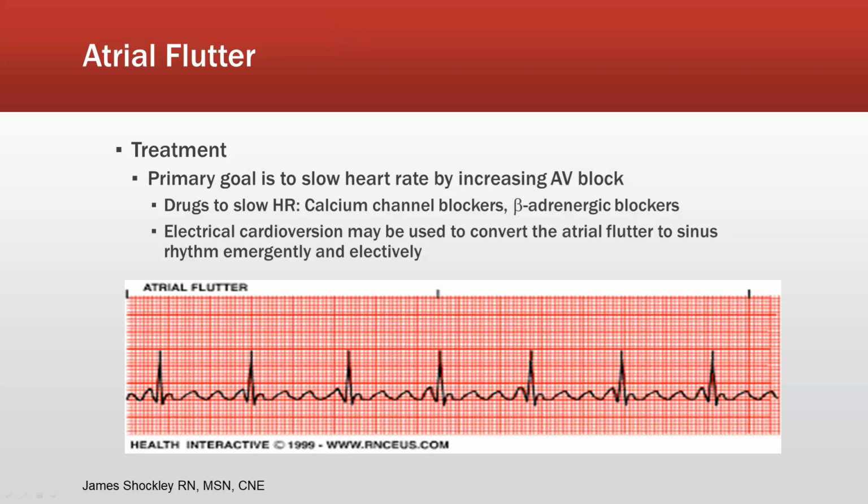So the first thing that I notice with this one is everything I said is mostly true. Some people will go, oh, well, that doesn't look like a saw to me. And I get it, right? But it's the best interpretation that I have because your R to R is consistent and there are no discernible P waves. And you can say, oh, well, isn't that the P wave? And I'm going to say, no, that's an F wave. I don't know 100% if that is a P wave.